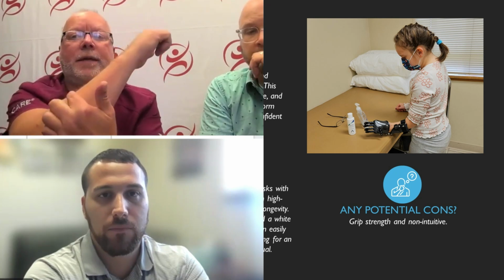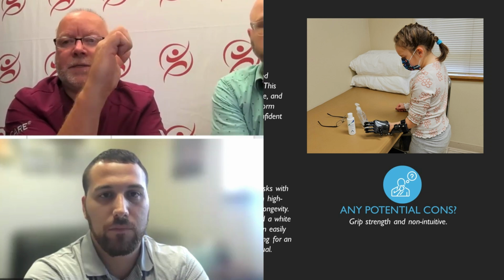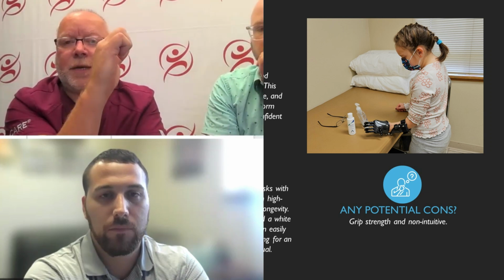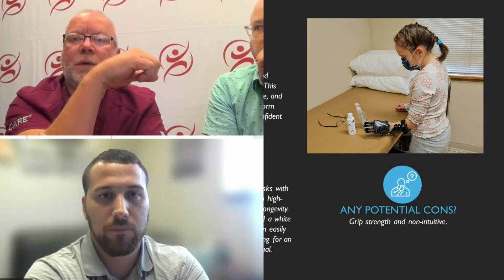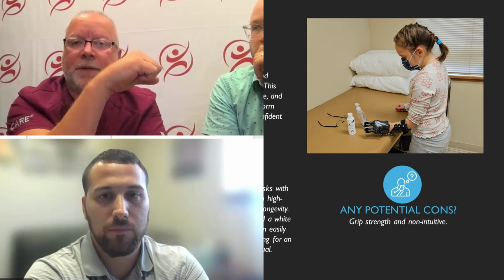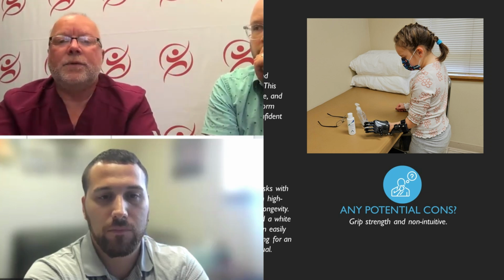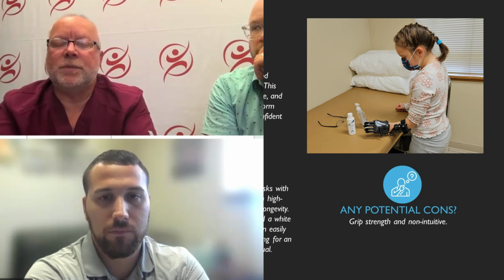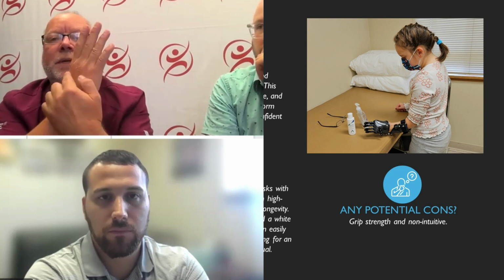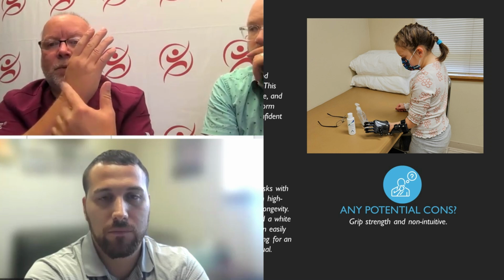There's a little dial right here that the patient turns, so they can either have their hand like this and it would flex the fingers with their hand being straight, or they can loosen it so that way their wrist would be flexed too, and then it would flex them down here. Okay, so that's all adjustable for the patient. They do work well, except for the fact that you're using wrist flexion extension, but sometimes that's the only thing that there is. So the amputation level is going to be at MCP or lower.